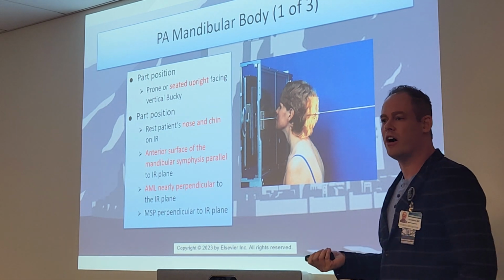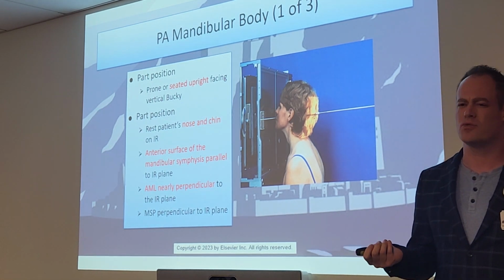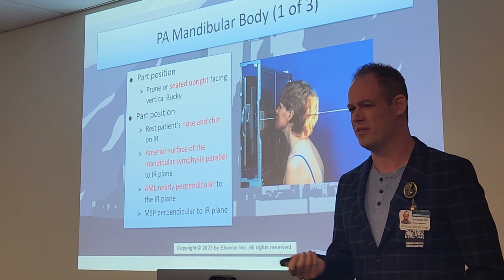So if the nose and chin are on the IR, their lips are touching the IR, which is why it's really important you clean that surface off for them.